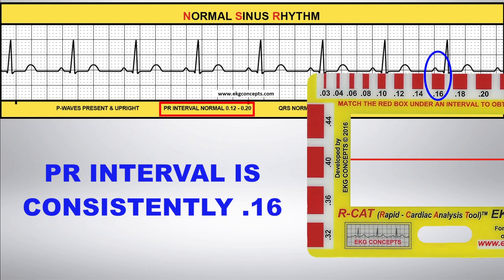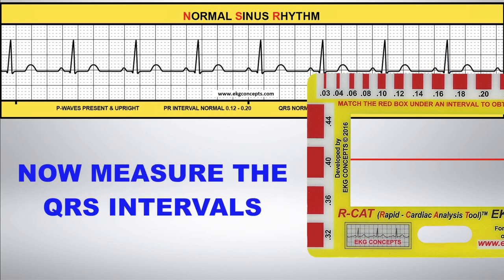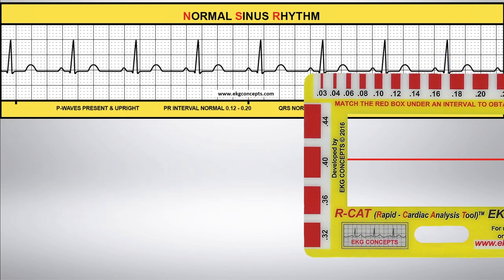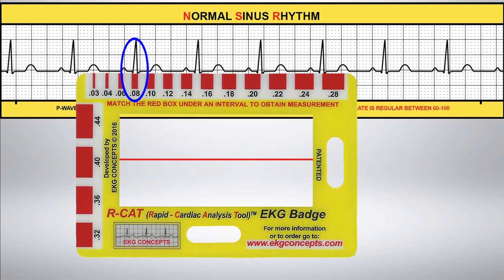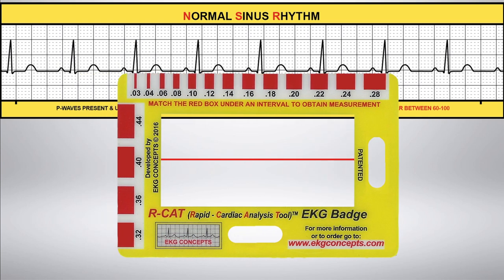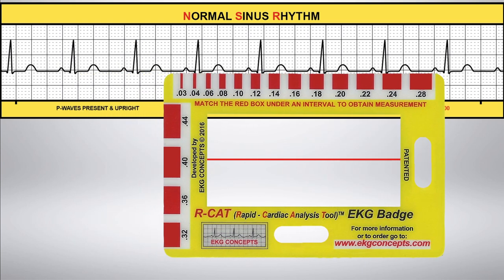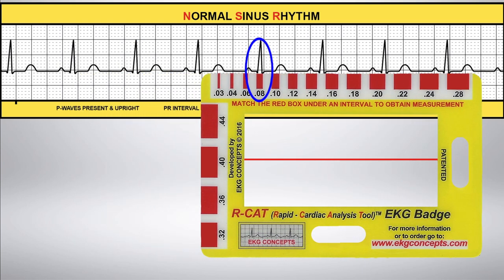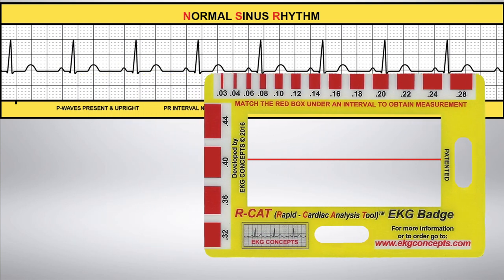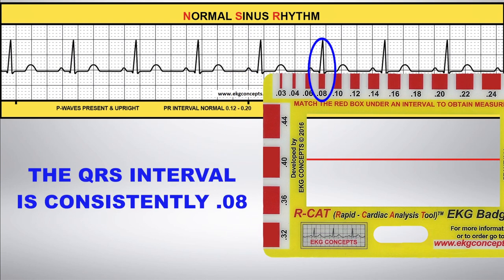Now use the calibrated red boxes to measure the QRS intervals. The QRS interval is consistently 0.08 and within the normal range of less than 0.12.